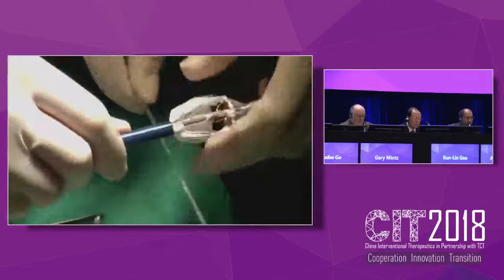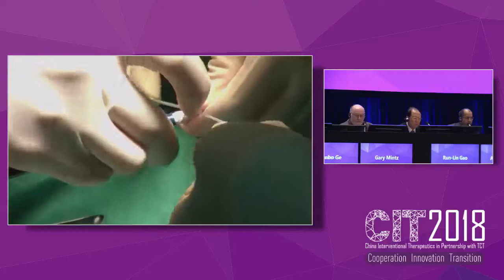So originally, to treat such a patient, we usually use a chimney. But as you know, the complication of the chimney is that the patient may suffer from endoleak. So that's why we try to use the fenestration.